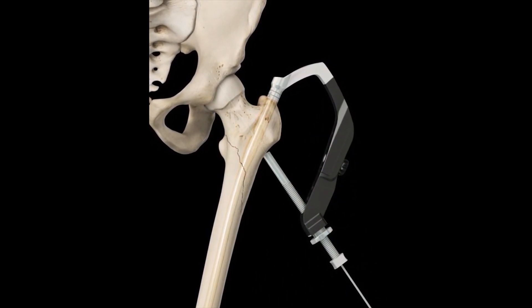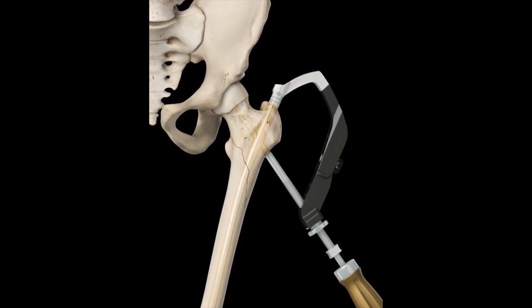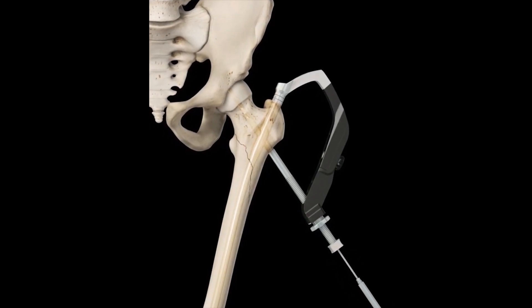An aiming arm is attached to this device in order to insert a femoral neck screw that corresponds to the hole in the short nail and is parallel to the axis of the femoral neck.